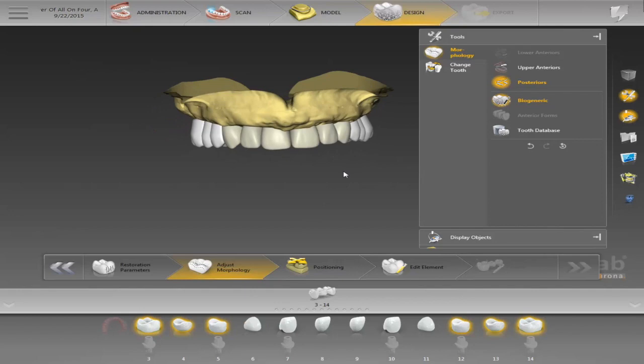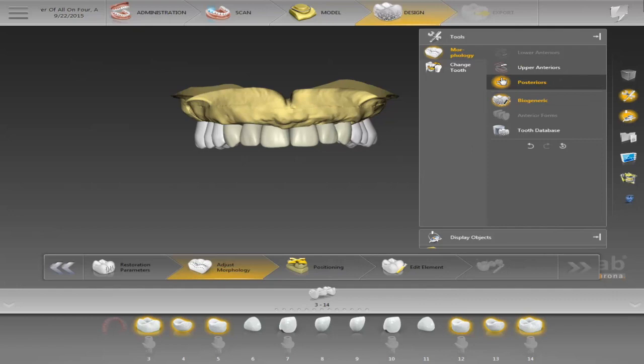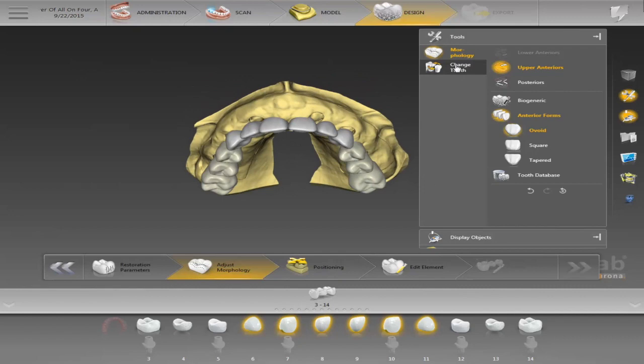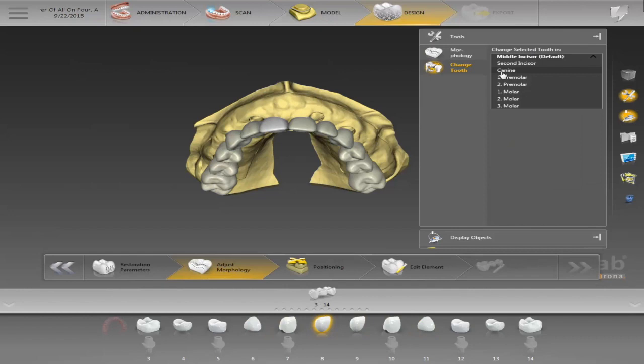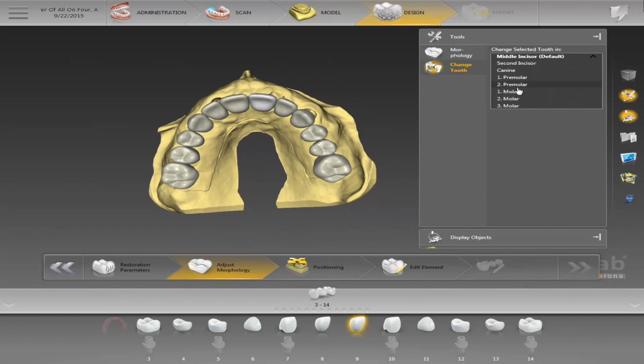For the anteriors, you can also choose different libraries. You can highlight them — you have ovoid, square, or tapered, those are really the only ones I use, but they have a bunch of different ones. It's whatever your choice is. If you decide to change a tooth — say you have an area where you can only have one bicuspid — you can choose whatever you want: one bicuspid, three molars, three bicuspids, change a number 10 and add two. You just click on it and you're ready to go.